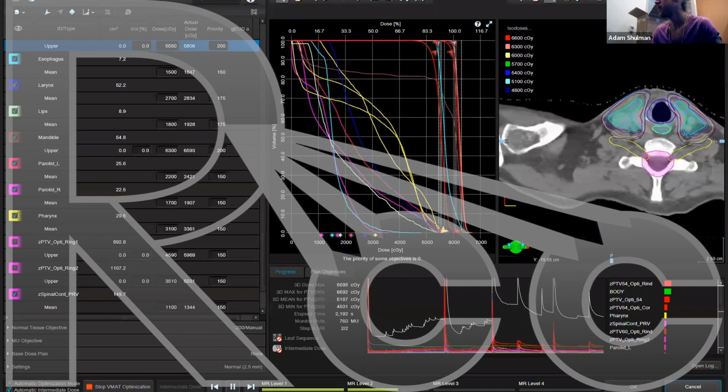So I don't want to give you particular clinical dosing advice. This will come from your radiation oncologist. So you need to ask your radiation oncologist. This will be dependent on what protocols are followed. Different radiation oncologists have different preferences on that, but I will remind you about the differences also between type B and type C algorithms.